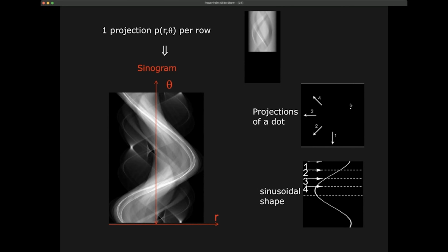Then the X-ray is almost fully absorbed, and we have this very high p-value. So we have a very low intensity that becomes a very high p-value, as we said before, because we do this logarithmic transform. We measure the high absorption here, and if we plot that in a horizontal line in the image, it will be a white dot there.